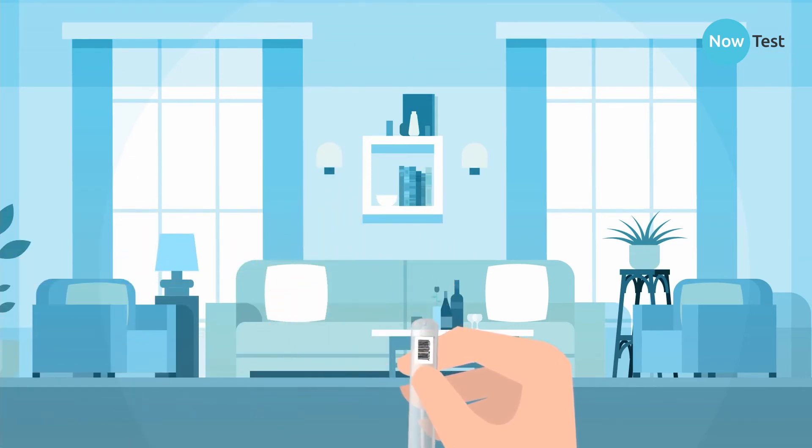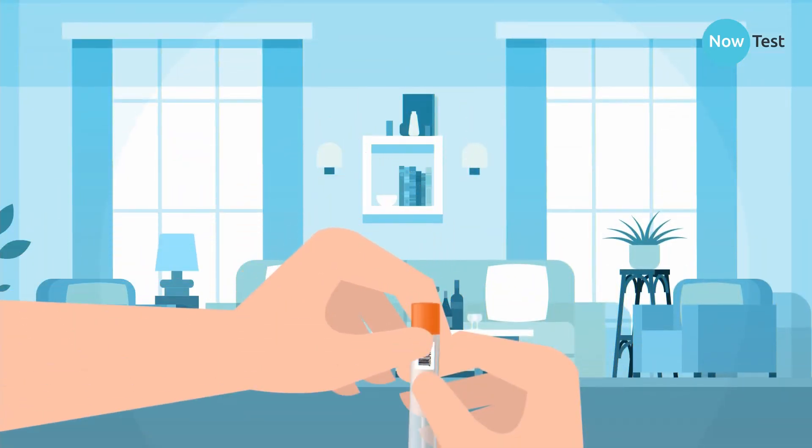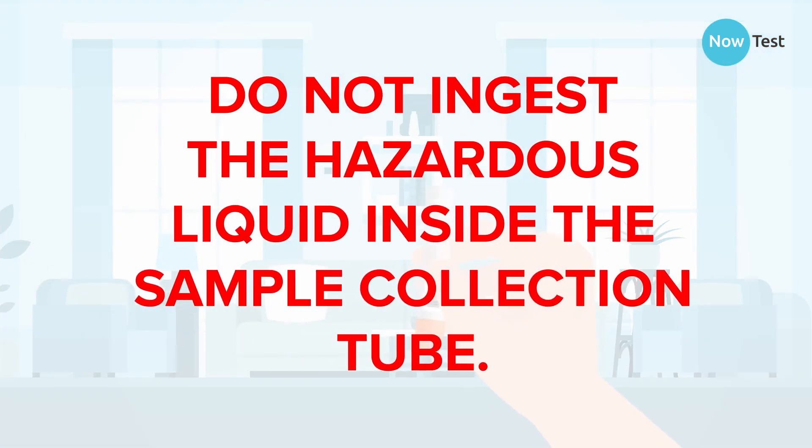Place the cap back on securely. Invert the sample collection tube 5 to 10 times and ensure that no liquid leaks. Do not ingest the hazardous liquid inside the sample collection tube. If you get it on your hands or skin, ensure you wash them thoroughly.